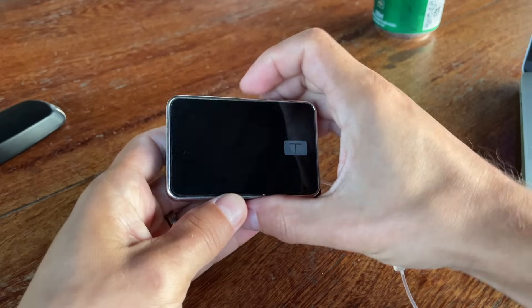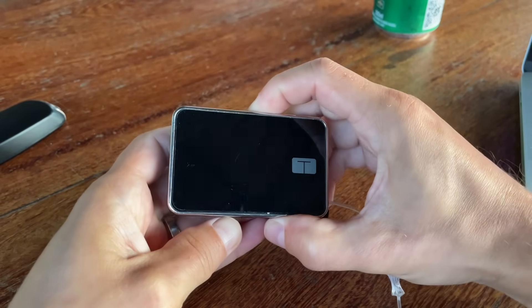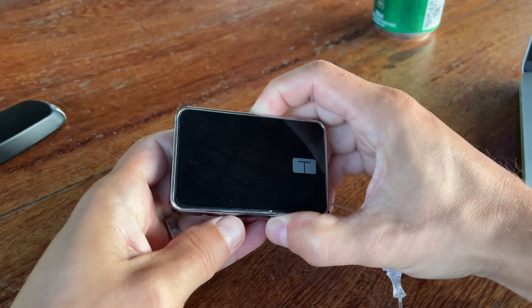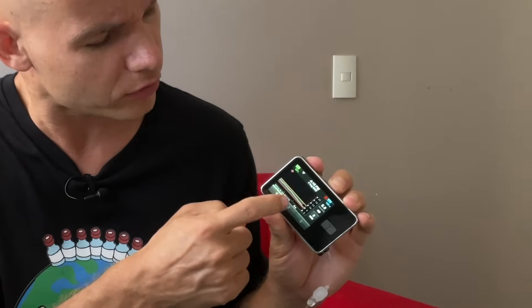A few minor things about the design that I don't like. Number one: the top button that you always need to press first to wake up the pump doesn't have a nice tactile feedback and you have to press it quite strongly. Apparently this is a safety feature, but I don't get why we need to press the top button if we then need to press 1-2-3 to unlock the pump anyway.